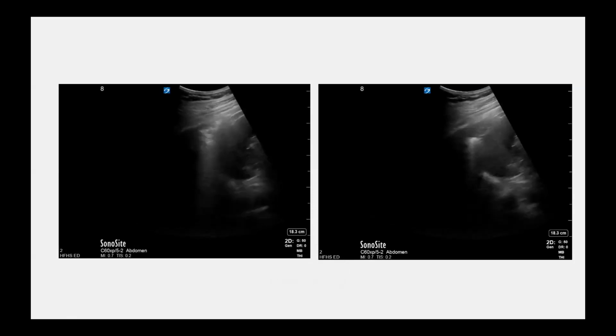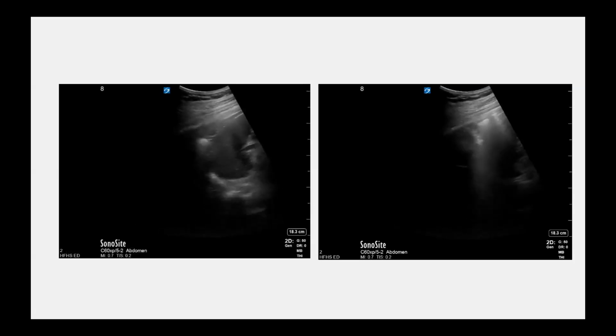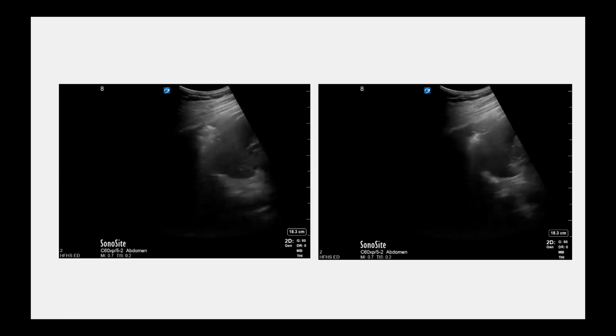That's it. So now you're looking at lung consolidation just deep to that area that's echogenic, and at the border or the transition between the normal visceral pleura where it's nicely aerated and deeper to it where you have the pulmonary consolidation, you start seeing the air bronchograms. Now, you see the same pattern in a patient with community-acquired pneumonia. You see it in COVID. So it's not a specific thing for COVID. It basically represents alveolar consolidation with air bronchograms, indicating an infectious process. So based on the clinical picture, in this case, everybody coming in with COVID, we have to assume that's what it is. But if somebody had pneumonia, we're going to see the same pattern as well.